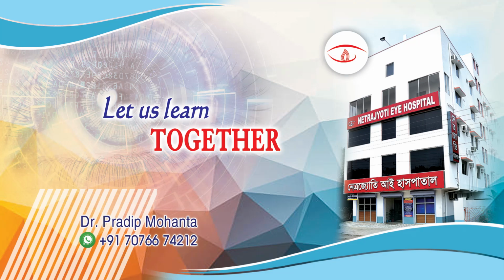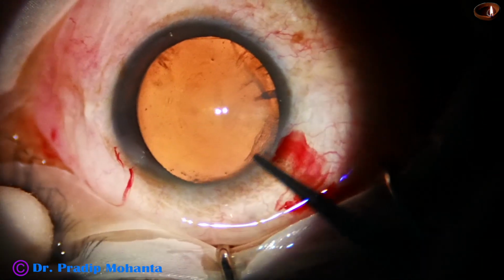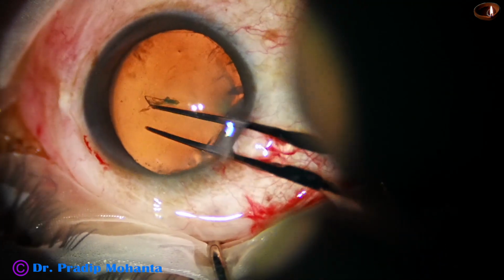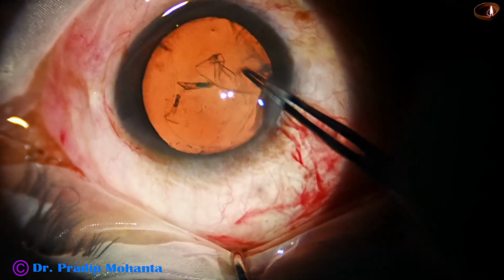In this video, we will see use of Mohanta's Prechopper in slow motion. This is a cataract with grade 2 nuclear sclerosis. After the initial steps, capsulorhexis is being done with the help of a Utrata forceps.